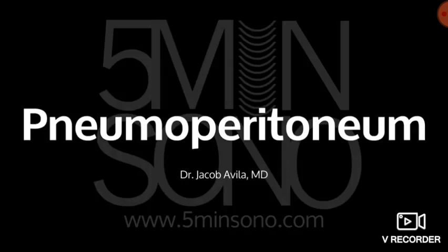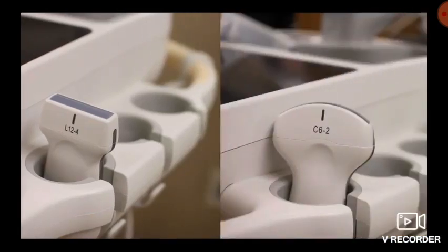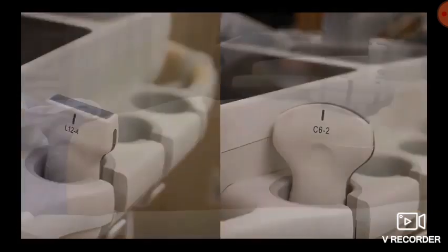Hello, my name is Jacob Avila of 5 Minute Sono, and today I'm going to show you how you can use ultrasound to identify pneumoperitoneum, or free air in the abdomen. The best probe for this is going to be your linear transducer. It's going to give you the highest resolution image, but the curvilinear transducer can work as well.